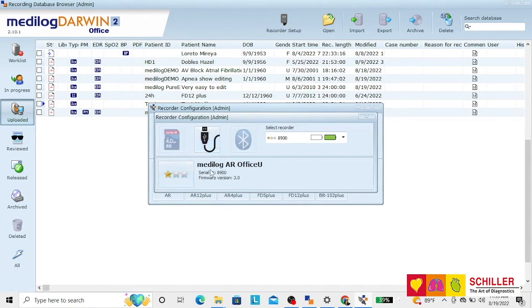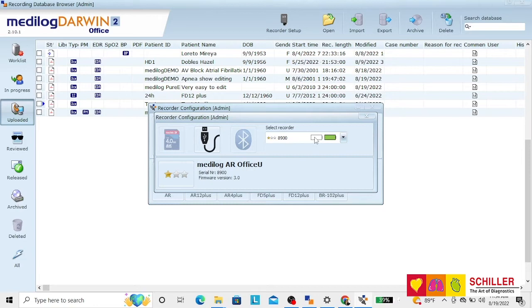You have the version of your recorder and two battery icons. The first one is the AAA battery. In this case it's not installed so there's nothing. And the second one is the internal battery charge.